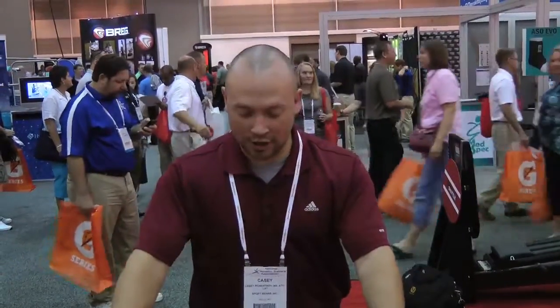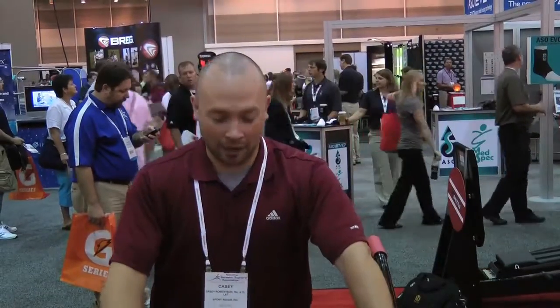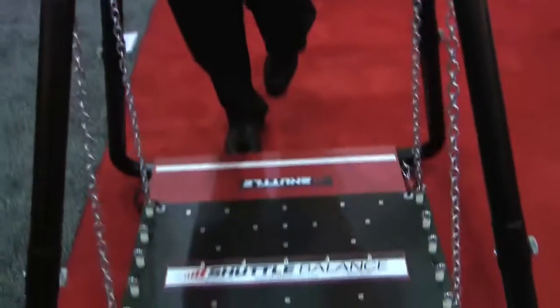Hello! I'm sure you guys recognize me from my many YouTube videos. Today we're in New Orleans for our annual convention for the Athletic Training Association. I'm here with the wonderful people of Shuttle Systems and I'm going to talk about progression on the shuttle balance.